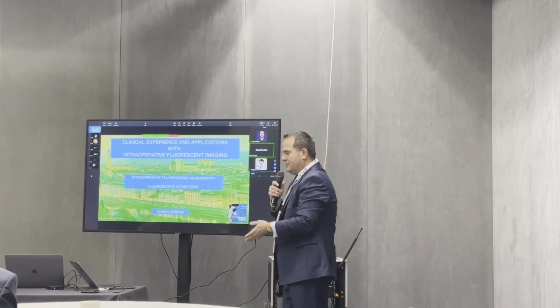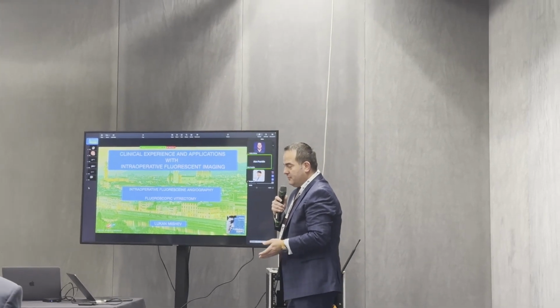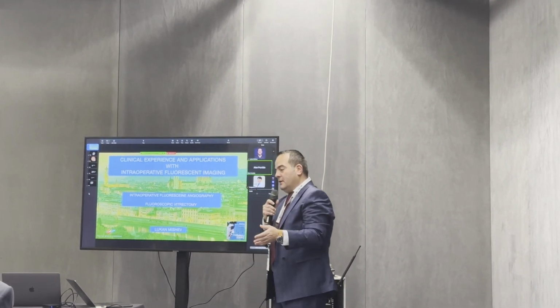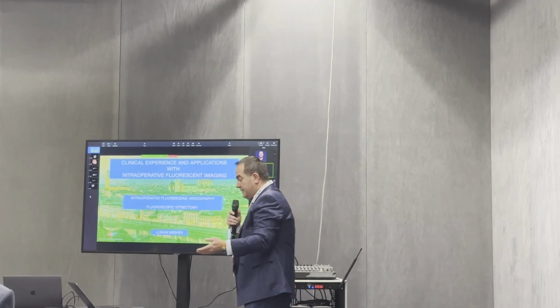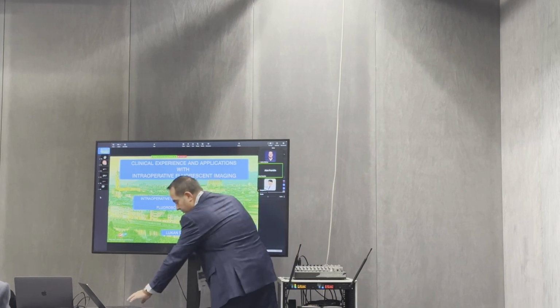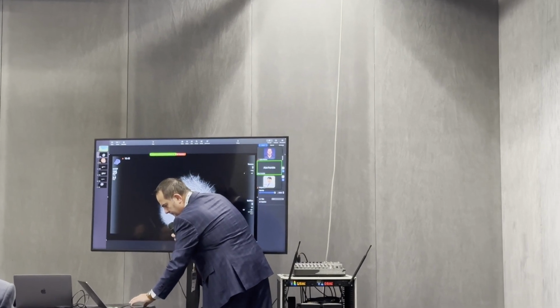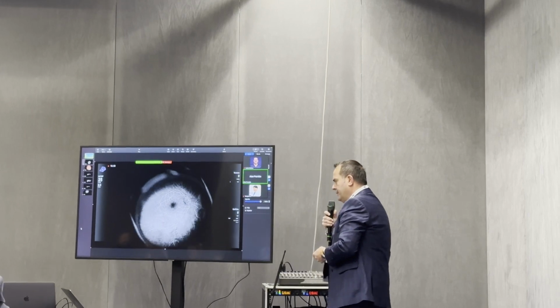About the clinical experience which I have and what application I found that are useful. I call it intraoperative fluorescent imaging already because it's not only the angiography, but we can also highlight the vitreous body, and other application can be drawn for that. So I will start with the first video, which is a case of arterial occlusion.